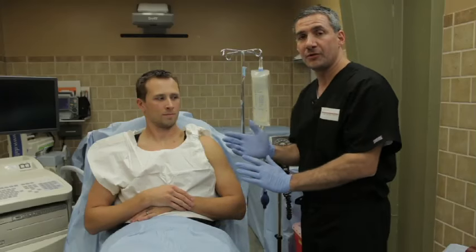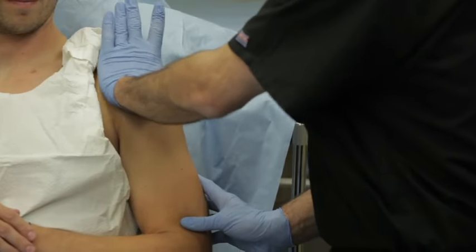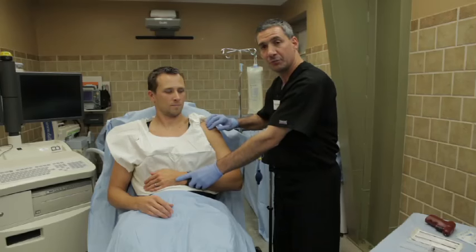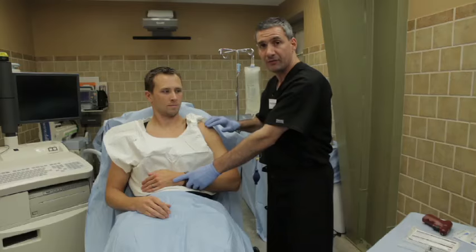Just to appreciate how anterior to the midline the proximal humerus lies, one can take the palm of your hand and actually palpate the anterior portion of the proximal humerus with the palm of your hand. The patient's hand should be placed over the abdomen in order to help internally rotate the humerus, to keep the intertubercular groove — which is where the biceps tendon is — medially and out of your field.